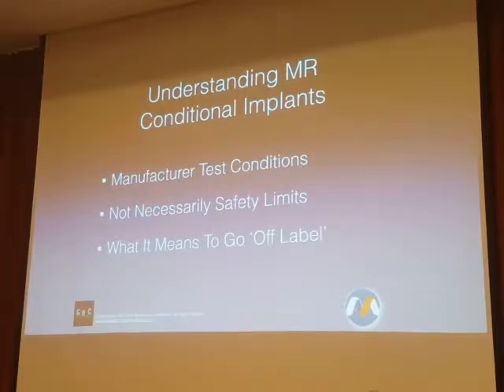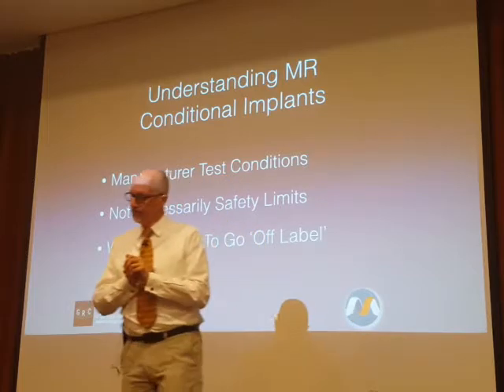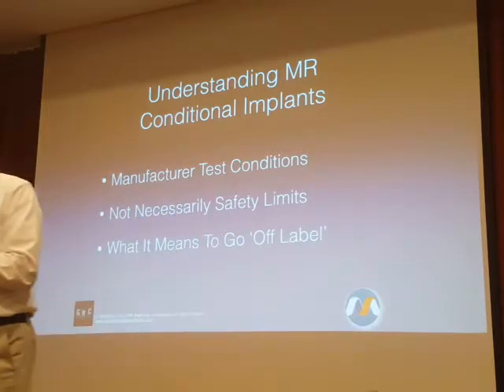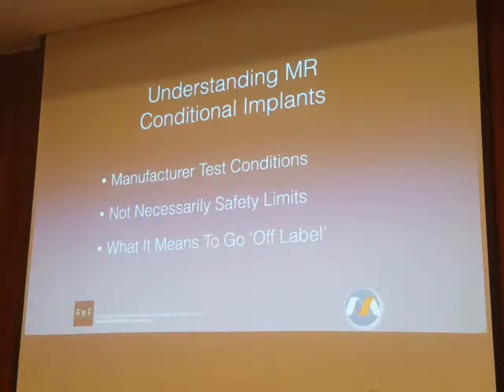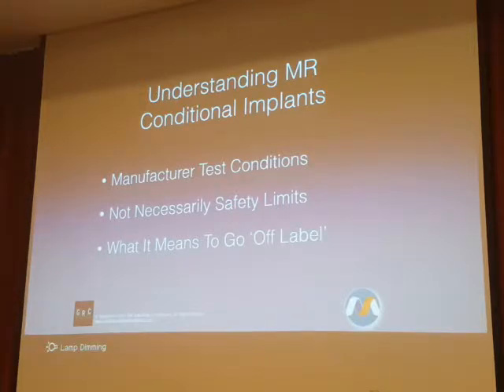But that's just the test conditions, the parameters for testing and labeling. Sometimes it depends on the company. Like with an ICD, we need settings before the MRI, specific settings for MRI. So it's compatible with MRI, but we need settings for that. Right. Yes, with active implanted devices, nowadays there are lots of them that have settings, or you have to check beforehand and then you have to check after.